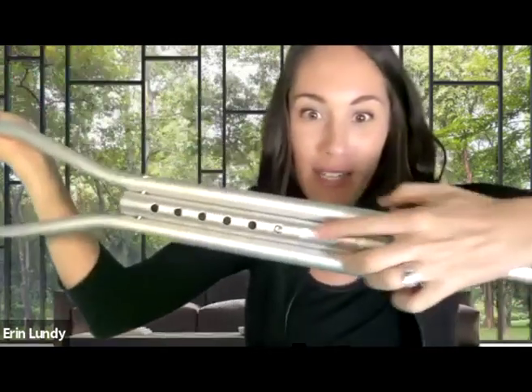So let's get started. First off, I would like to show you how to adjust these, because I'll go out on the street and see a lot of families out walking with their kids, and I'm like, oh, that crutch is not fitted well. Starting off, you see this little button down at the bottom of the crutch, where the little base is. You can press that button in and then move this shaft up and down based on the appropriate height. Now, how do you get the appropriate height? The little handle here is going to be measured to your kid's styloid process, that little bump in their wrist. You can find it, and that's exactly the height it should be.